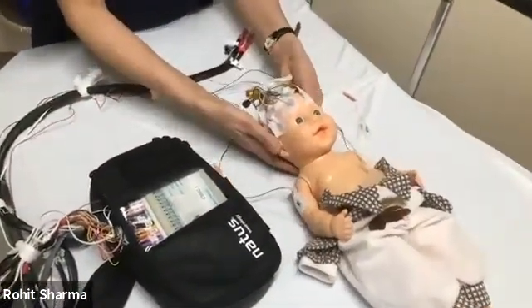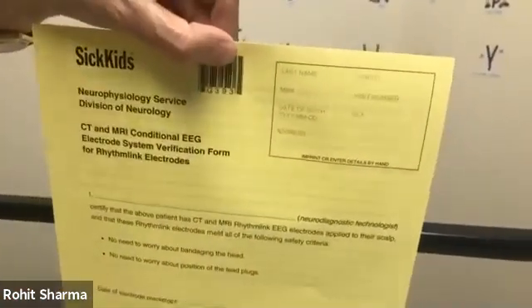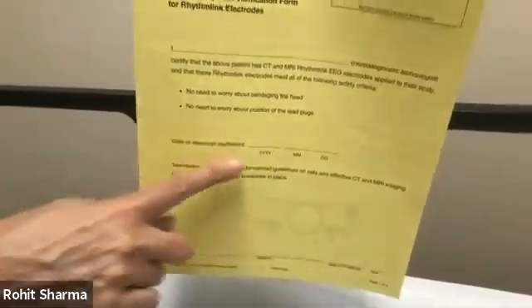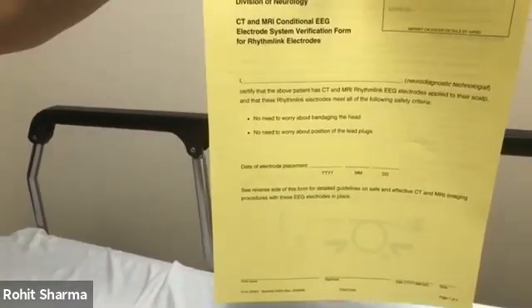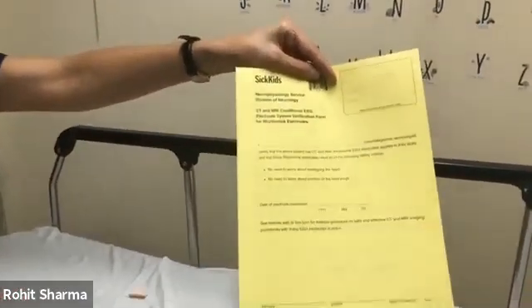The other thing you need to remember is you need to remember to take this yellow documentation sheet. It actually will have the patient's sticker with his name, date of birth, and everything else in a barcode. And this will be signed by the technologist to put the electrodes on, what date and what time they were applied. So that helps us to annotate what time. You need to take this with you every time you go to CT MRI. This is usually attached to the machine or at the end of the patient's bed.